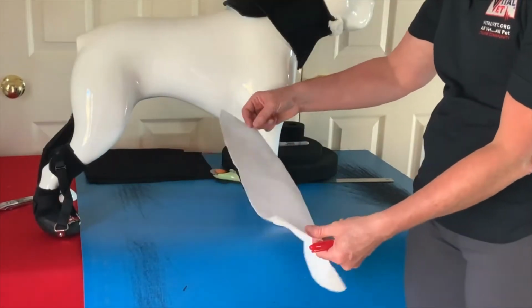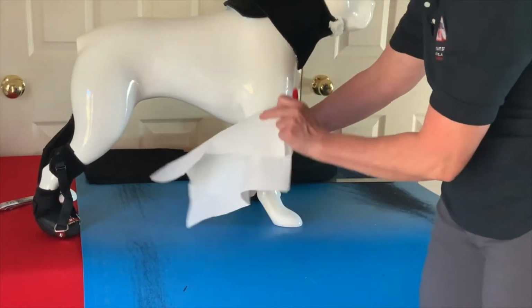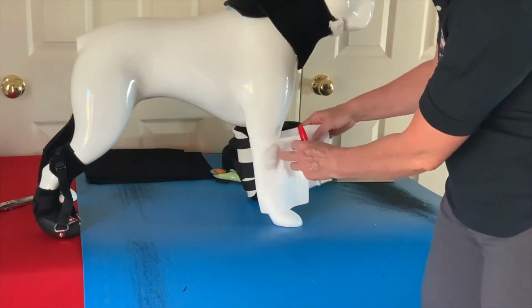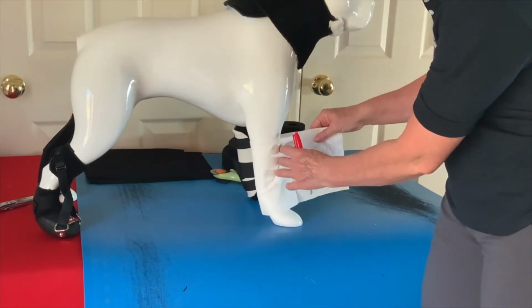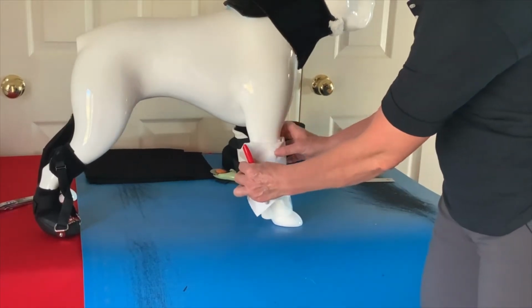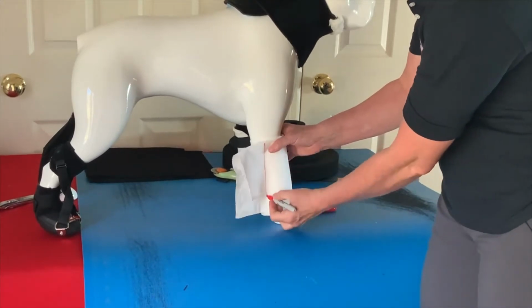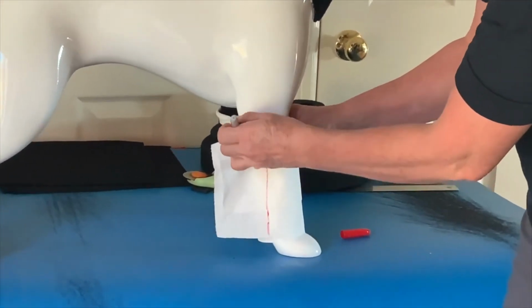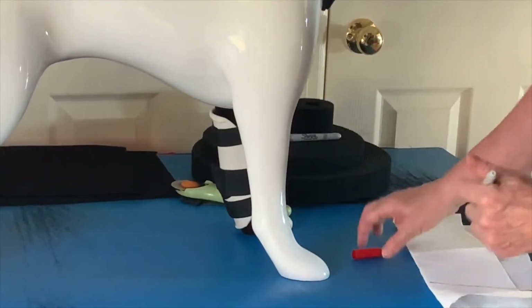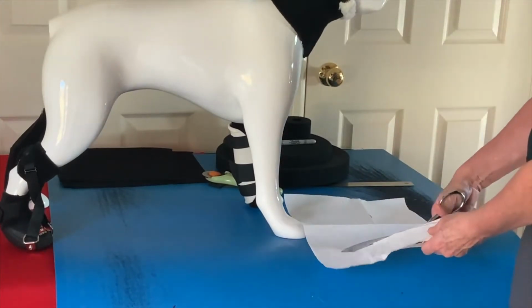Use a paper towel to make a pattern of the general size of the limb. This will be a circumferential brace, so the paper pattern must not only wrap around the whole limb, but also allow room inside for padding and enough material to overlap and close the brace. Be generous with your pattern and make it a little bigger than you think that you need. You can trim it all later. Then cut your paper pattern out with the scissors.